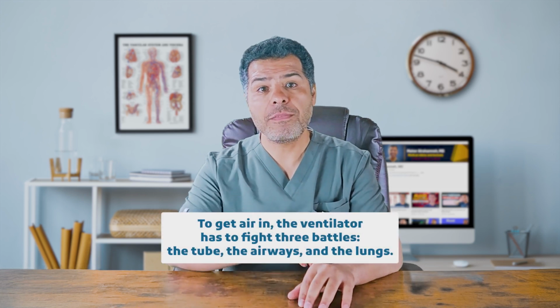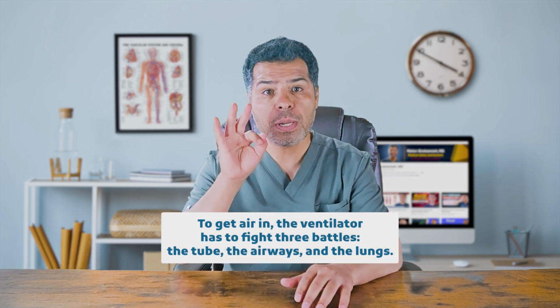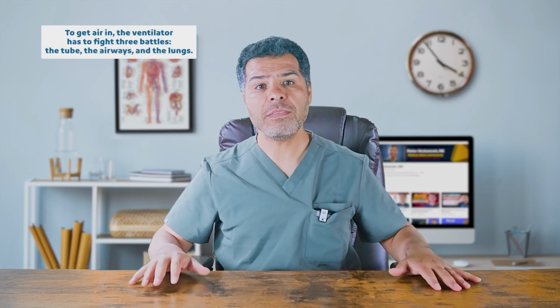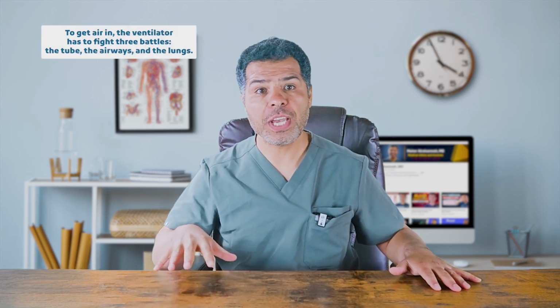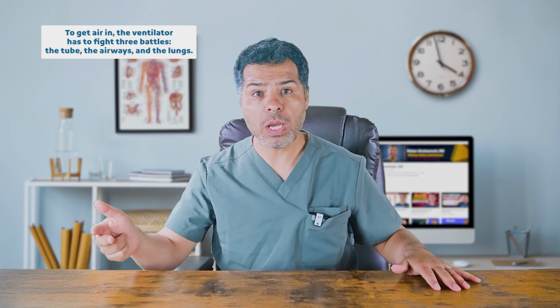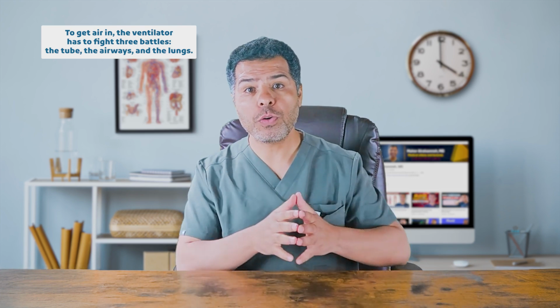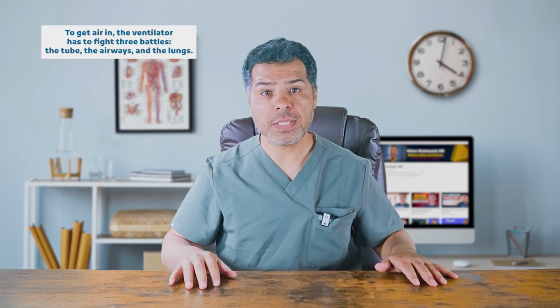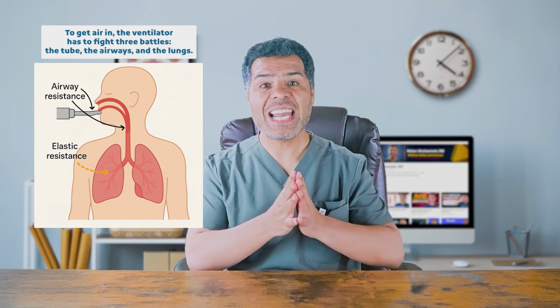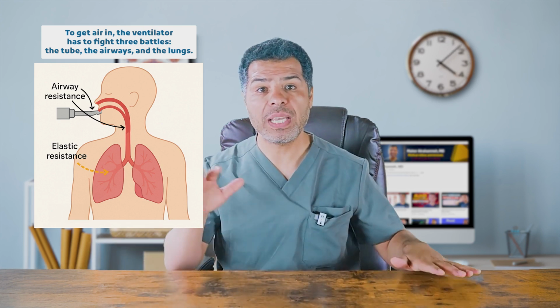Let's move to the fourth concept. To get air in, the ventilator has to fight 3 battles: the tube, the airways, and the lungs. During mechanical ventilation, the ventilator delivers air through the endotracheal tube, down the airways, and into the alveoli. To do this, it must overcome 2 main types of resistance: the airway resistance from the ET tube and conducting airways, and the elastic resistance from the alveoli and the lung tissues.